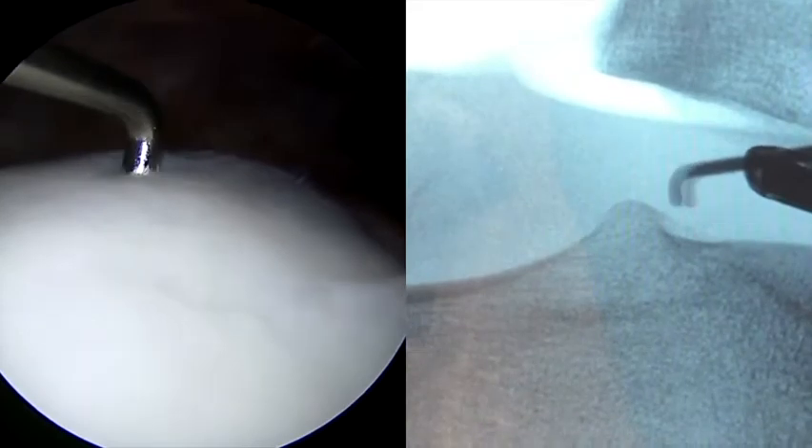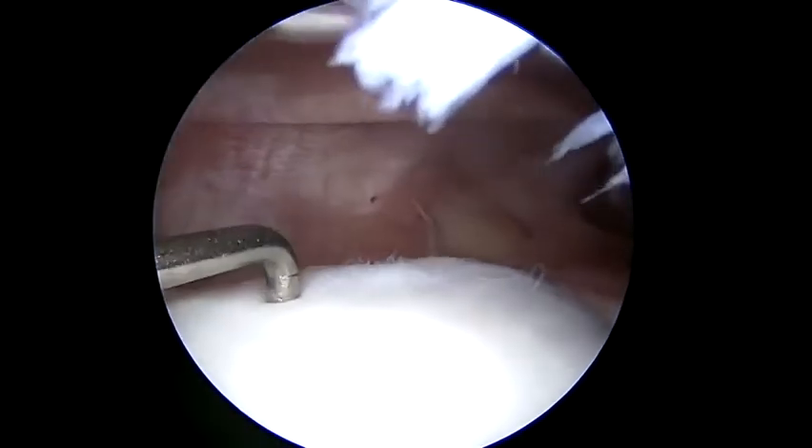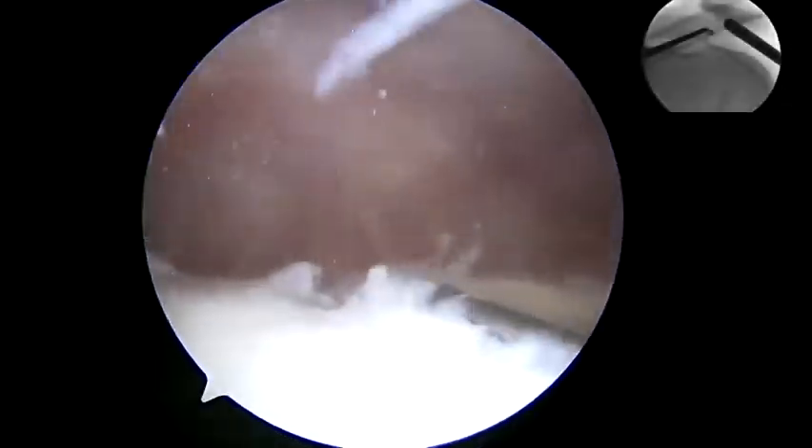This bump is typically proximal to the posterior condyle line drawn perpendicular to the femur, as discussed in the preoperative planning. We then postage stamp using fluoroscopy to demonstrate where this should be located so we know where to start our resection.